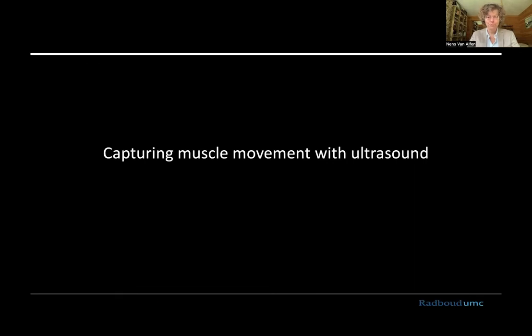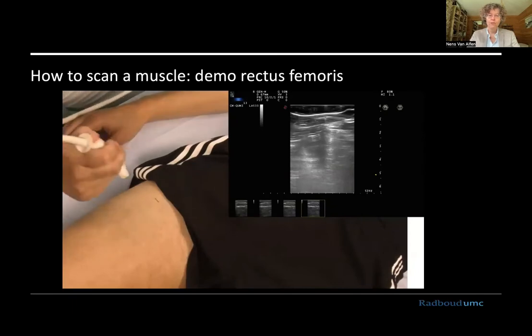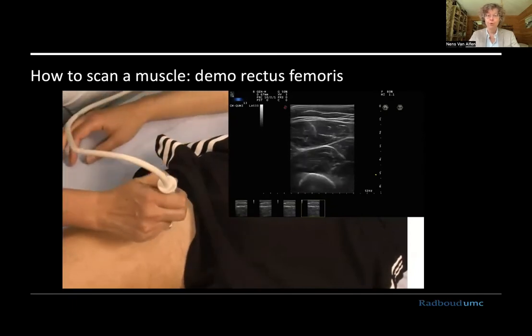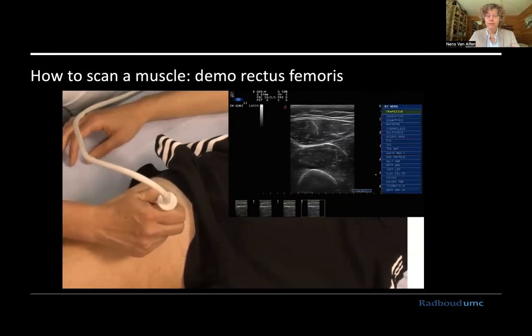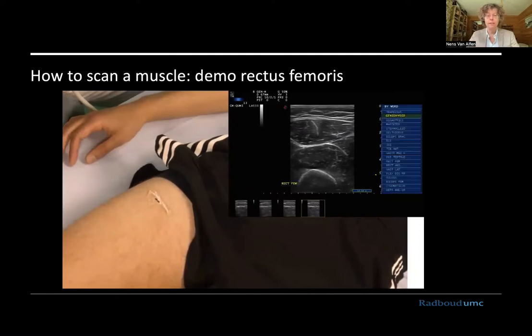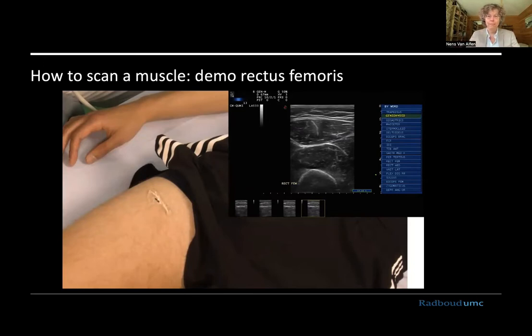So let's start with this presentation on the use of neuromuscular ultrasound for the detection of fasciculations. How do you capture movement with ultrasound? Here's a short scan demo of how we approach muscle ultrasound. You find a standardized location, usually at the site of the maximum bulk. You put a little pen stripe on the muscle and the skin there, and you capture an image three times. You look for the optimally bright image, meaning that the reflections of the bone and the intramuscular fascia are as bright as they can be, by angling the transducer until the screen is optimally bright. Most ultrasound machines also have video capture, so you can select a preset that will allow you to capture it forward and look for any abnormal muscle movements.